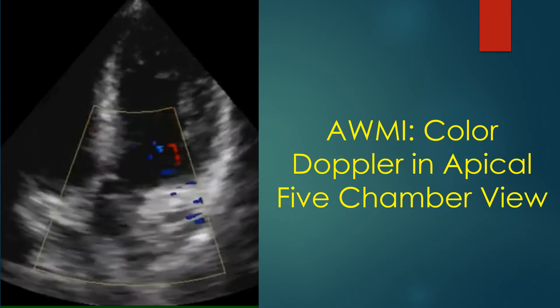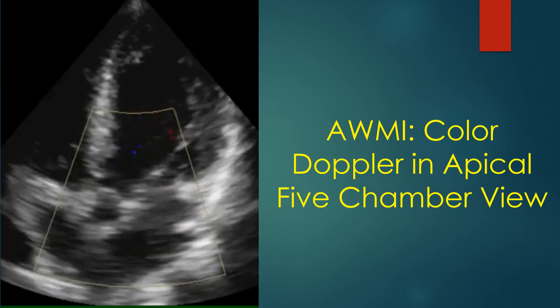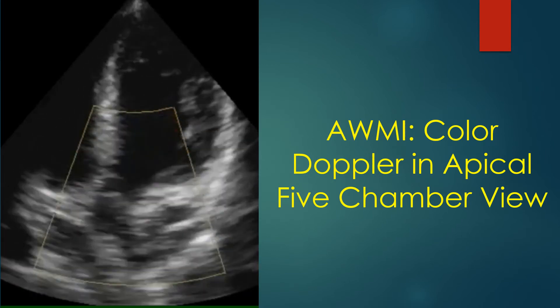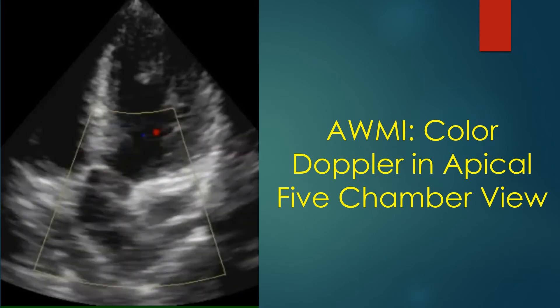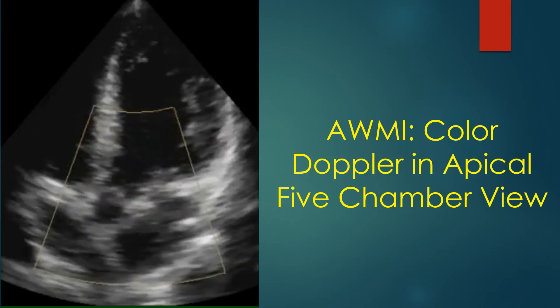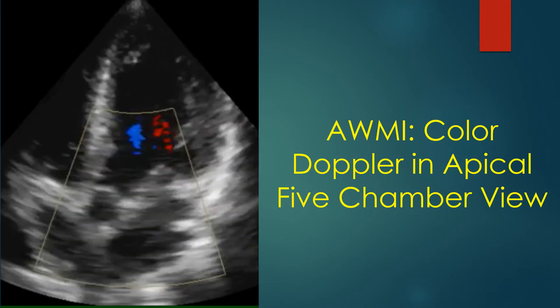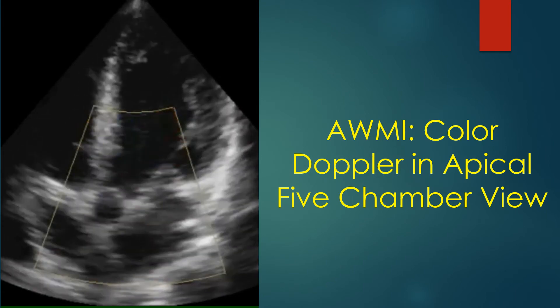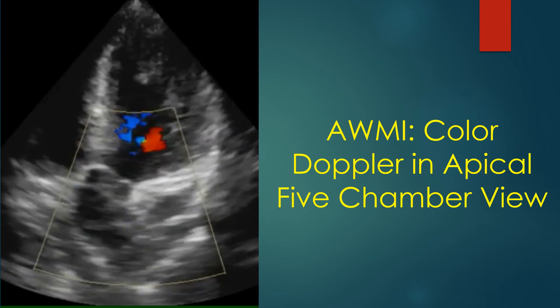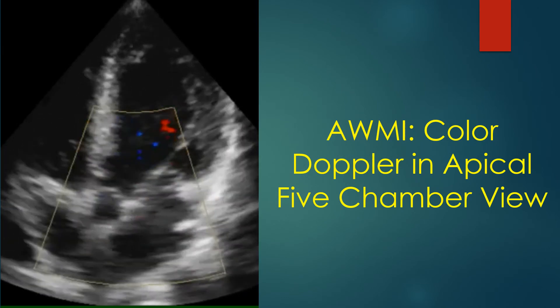Apical five-chamber view with colour Doppler imaging shows the aorta and aortic valve in addition to the four cardiac chambers. Blue flow away from the transducer is seen in the left ventricular outflow tract and proximal aorta.